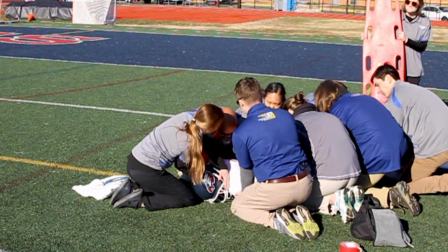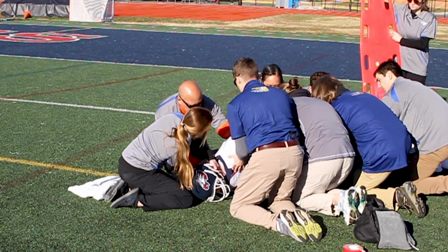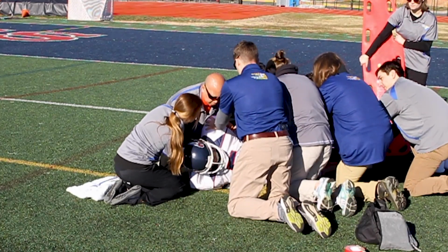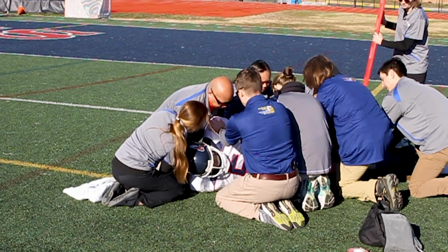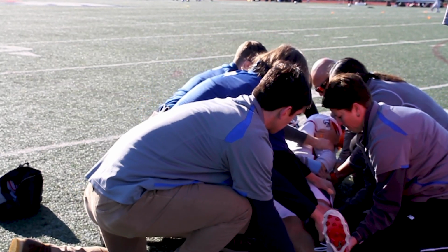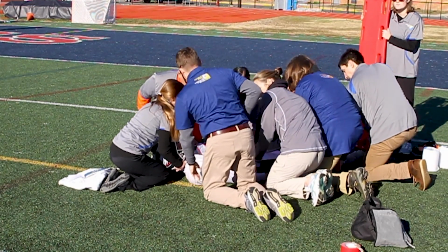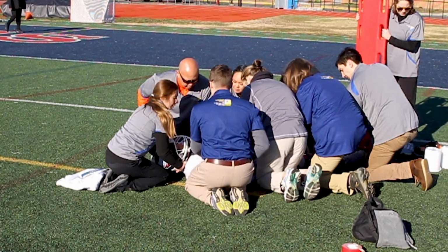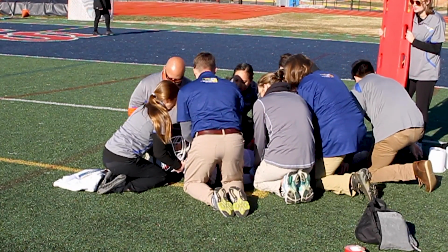On the count of the lead, the team works to roll the athlete up on one side. This limits torsional movement in the spine, gives the team a chance to reposition, and helps control the momentum of the athlete. One side is pushing and the other side pulling, all in one motion, keeping the head and helmet in neutral with as limited movement as possible. Even small athletes may need many hands and support. Ideally, there should be 4 team members on each side.